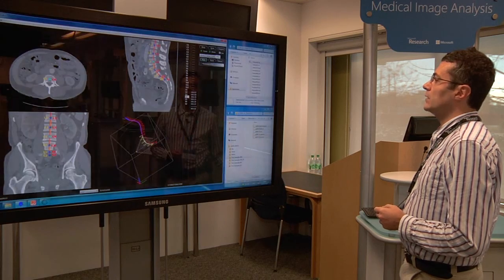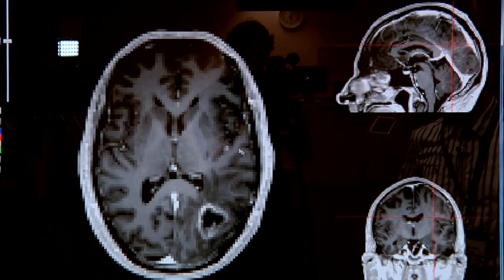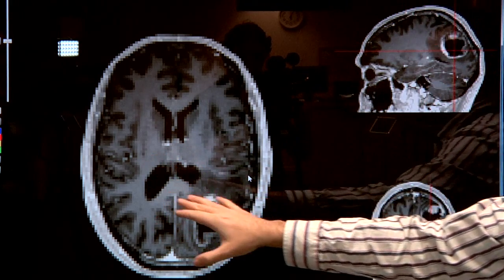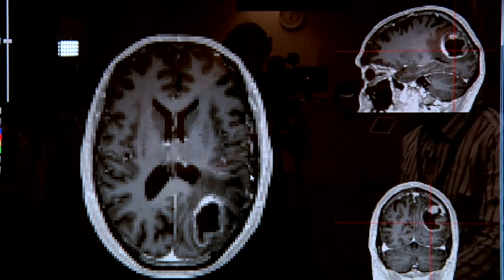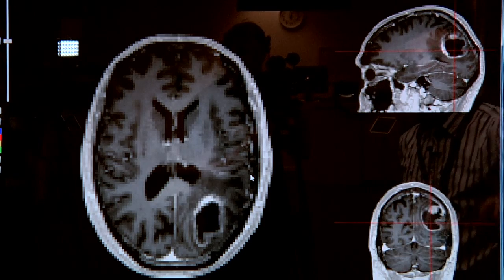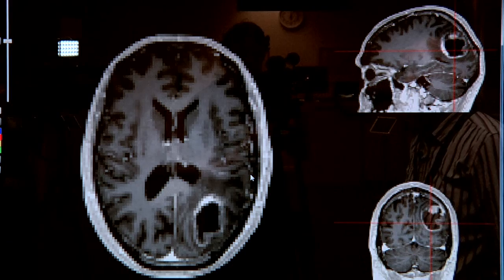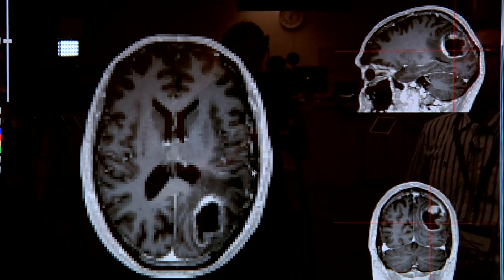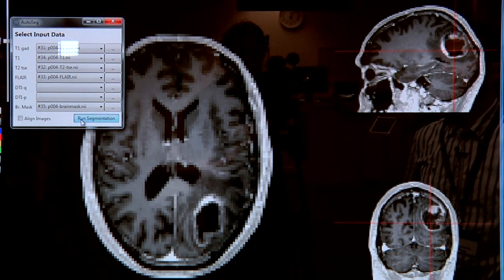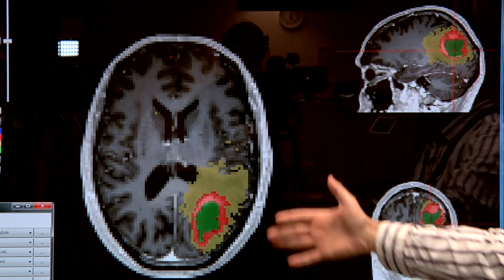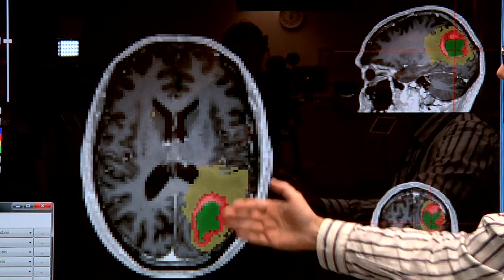So we have another application. I'm going to select a patient, drag the images in, and the images get loaded. Here you have the tumor. The black regions are ventricles — healthy. But this region where you see black in the other lateral and frontal views — that's the tumor. The black region is necrosis where brain cells have already died, and around it you see an enhanced white rim — that's the proliferating edge. I click run segmentation, and in front of you the color-coded segmentation is computed and refined as we speak.